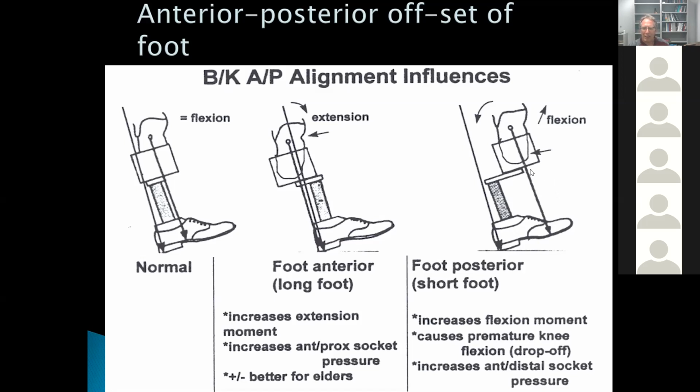Or if the foot is too short, what this would really do is that the foot is too far posterior, then you have a high knee flexion moment during terminal stance. So as we were describing, if the toe lever is short with those patients, then that would shorten the step length on the opposite side.